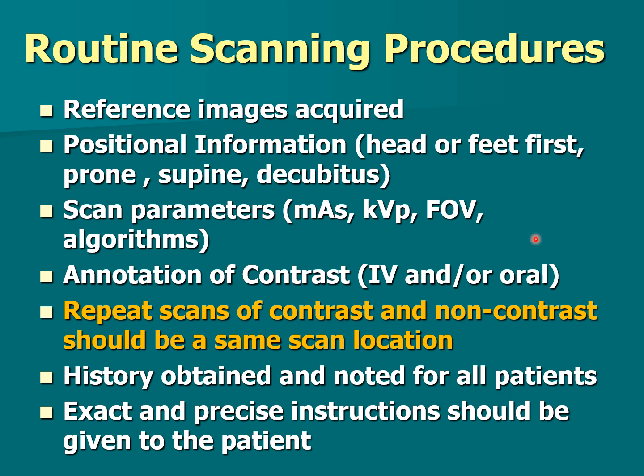This is general information that we will do almost any scan that we do. You're going to enter positioning information into your protocol. Let me say that many of you may have a protocol that says routine head or trauma head or cardiovascular imaging of the head. This information will already be inputted in there, but someone at some time had to set up this protocol. So this is information that you're either going to put in or that is in your protocol.